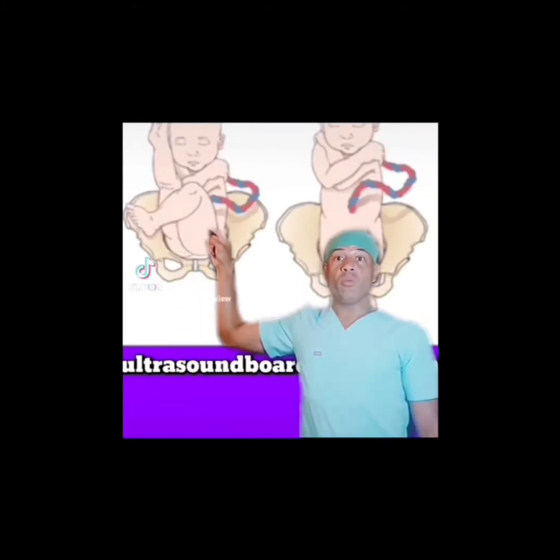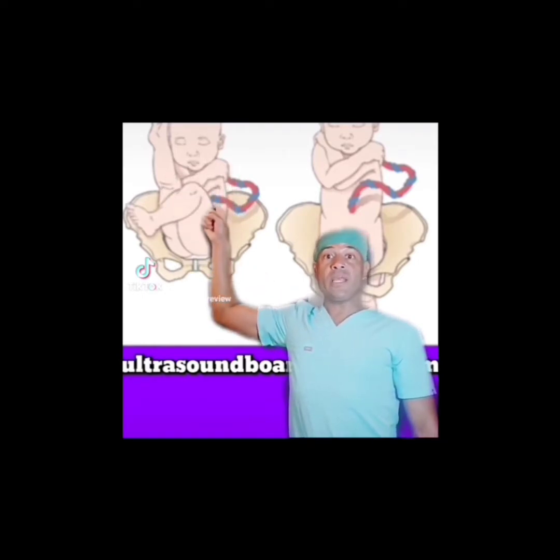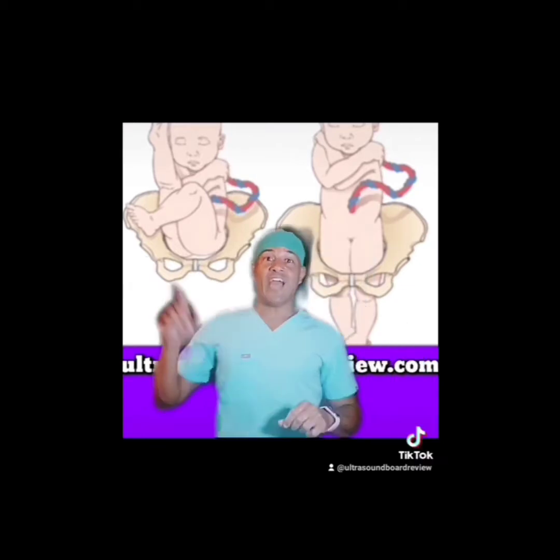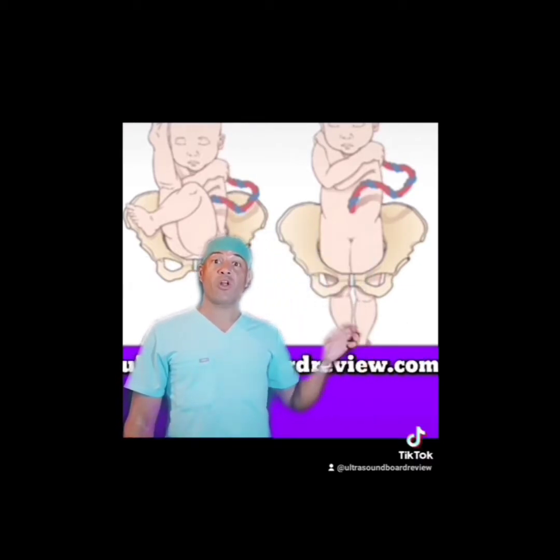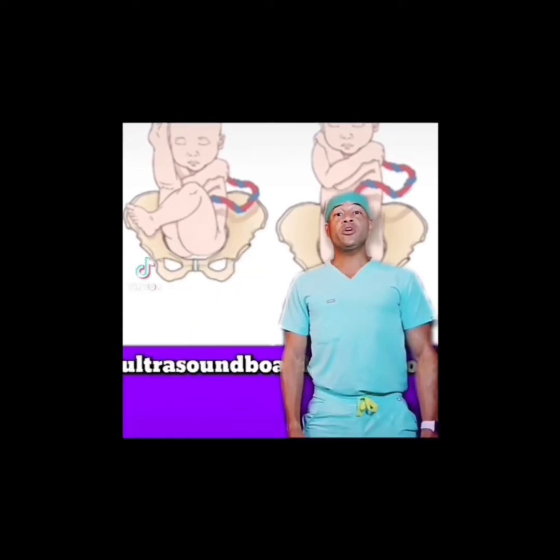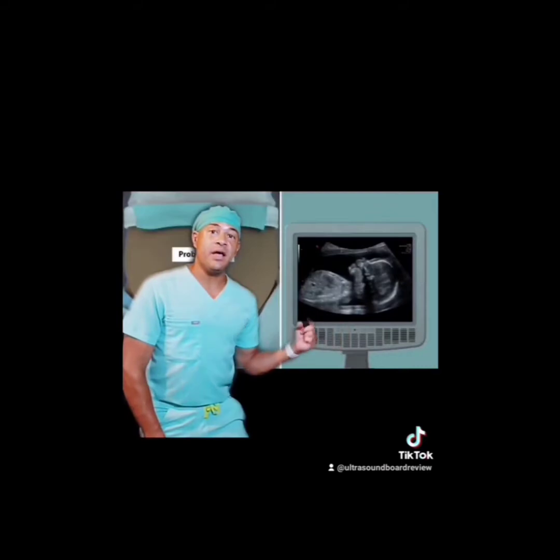This is called an incomplete breech, where both hips are bent with one knee extended up with the foot closer to the head, and one knee will be bent with the foot and bottom closer to the birth canal. And this is called a double footling, where both knees are extended and both feet are closer to the birth canal. To quickly determine fetal presentation, place your transducer in the sagittal view with the body marker or index pointed towards the mother's head. This will quickly give you an idea of the baby's position.